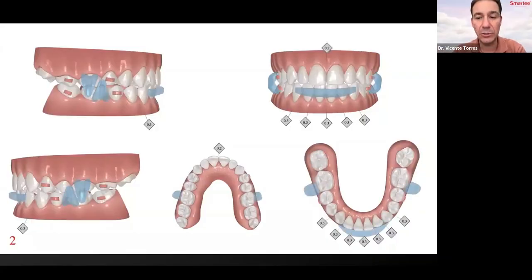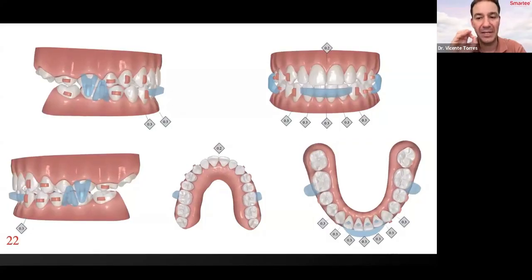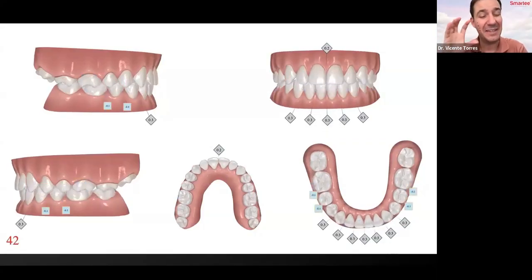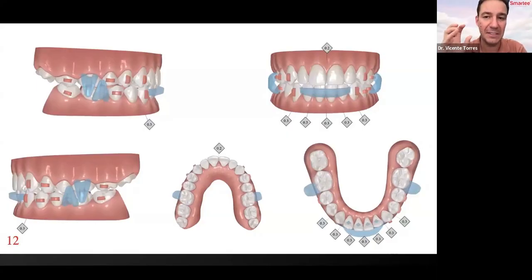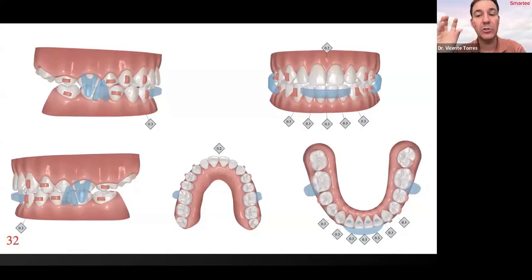And the other solution you can see there in the lingual surface of the incisors is the tongue crib. The tongue crib is to correct the tongue habit. This is important not only for the aligners. In this kind of case, even if the patient is an adult, if the patient has a tongue habit, normally I send them to the tongue therapist, because it's very important to correct the habit.